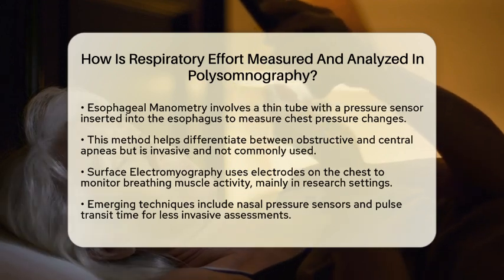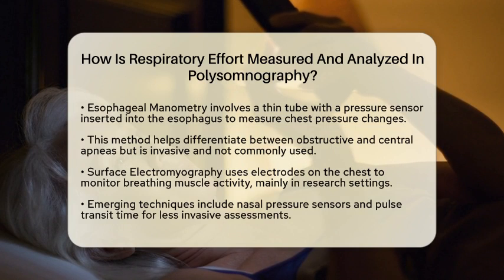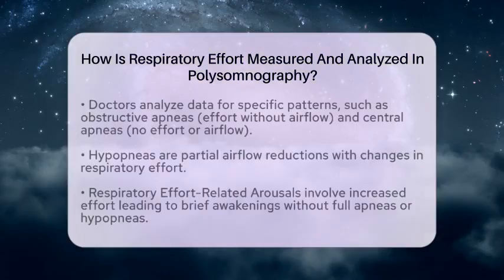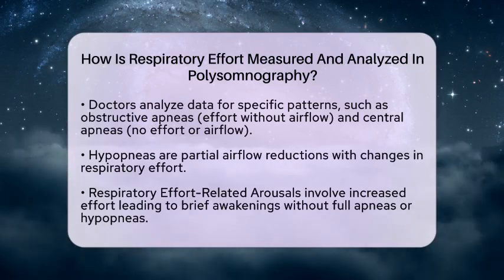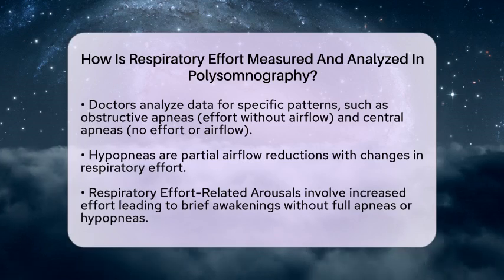Surface electromyography is another approach, where electrodes are placed on your chest to monitor the electrical activity of your breathing muscles. This method is mostly used in research rather than clinical settings due to its limited validation. Emerging techniques like nasal pressure sensors and pulse transit time are also being looked at. These methods aim to provide less invasive options for assessing respiratory effort and airway resistance.